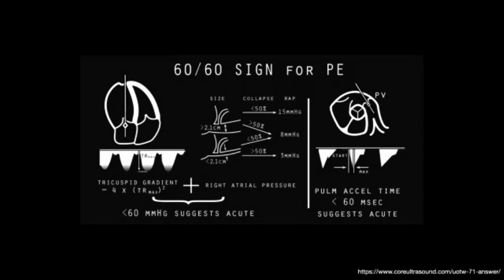And what you get is this waveform, which in normal individuals slopes up somewhat sharply, but then it descends kind of gradually. In patients with pulmonary hypertension of any etiology, there's a sharp increase in the pressure. So when the right ventricular ejection occurs, there's a rapid rise in the pressure waveform, and then you see a reflection wave.